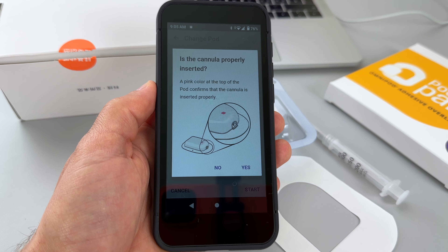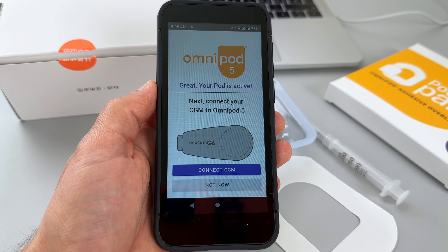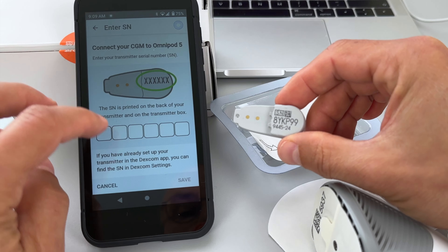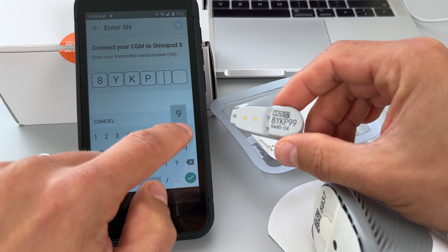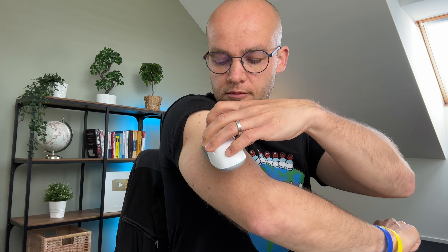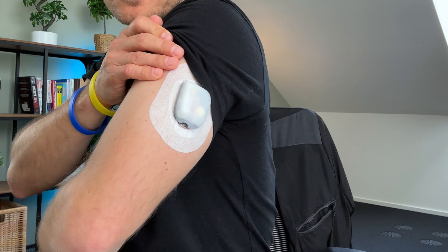I'm going to remove this plastic tab — you really need to pull quite strongly. Don't worry, you will not break anything. We'll check that the cannula is not sticking out, then remove the paper backing of the adhesive and apply the pod on my arm exactly on the spot I cleaned with the alcohol wipe. This was my first time doing this while recording on camera — I was really nervous, and of course I messed up. Look how I folded the adhesive! I tried the pod pal overtape but folded that on the opposite side too.